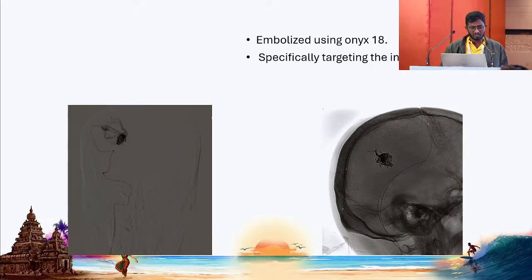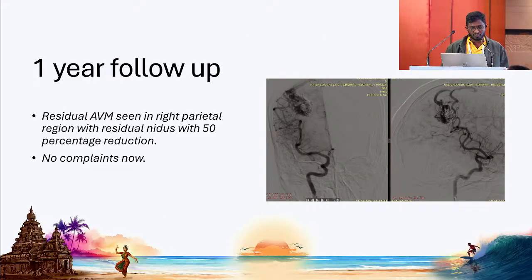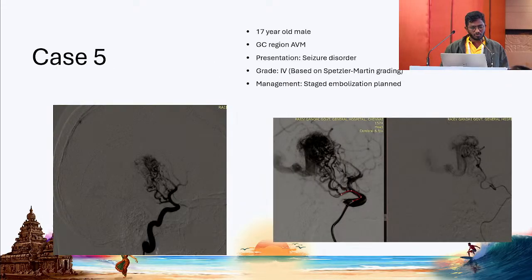This nidus was embolized using Onyx 18. This is the 1 year follow-up. After SRS, the lesion was still 50% present, but the patient has no complaints.